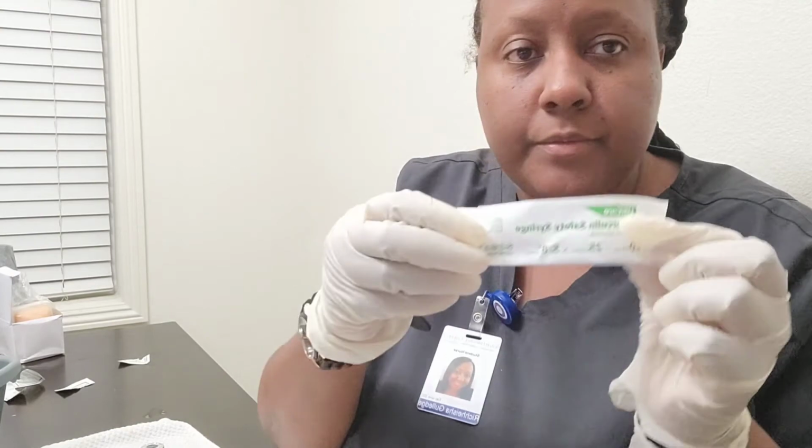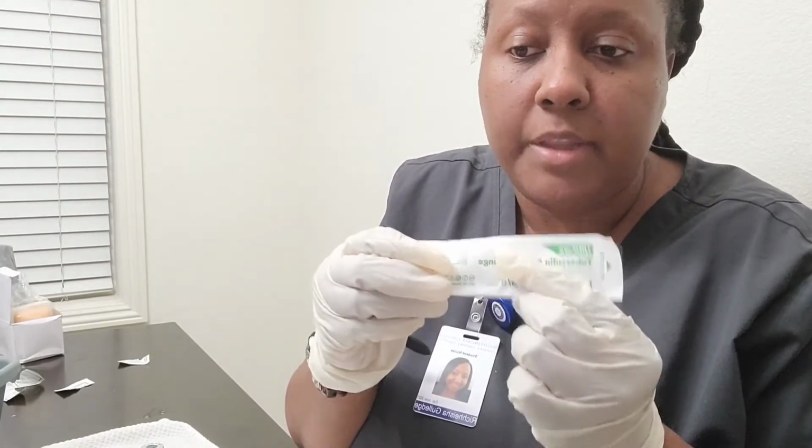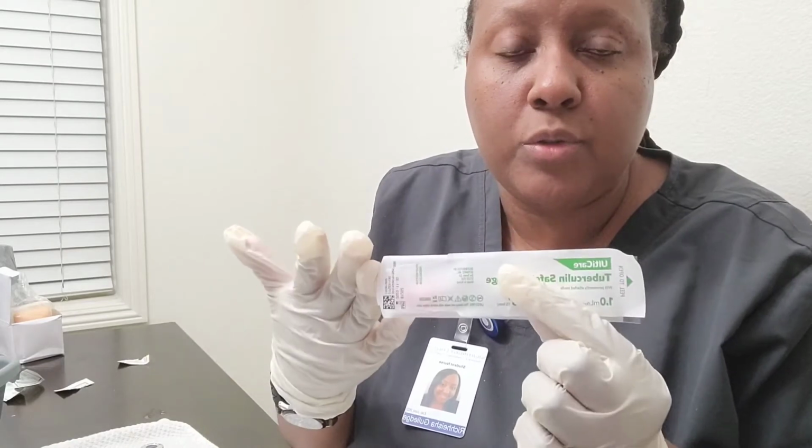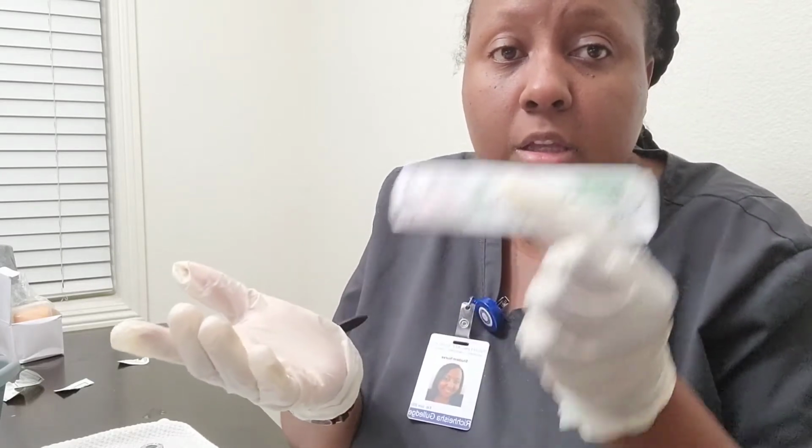I would like to note in my kit, I only received these and also insulin. Those are the only 2 insulin syringes and this one. So those are the only 2 that I received in my kit. So I have to use that. I received a few of these.